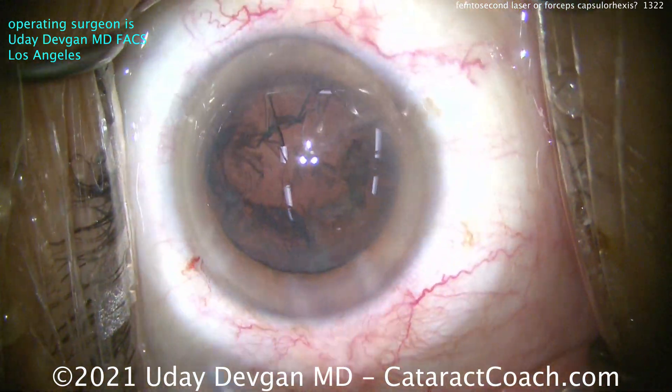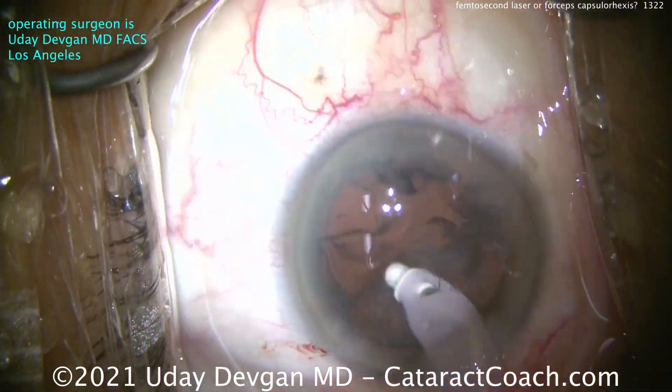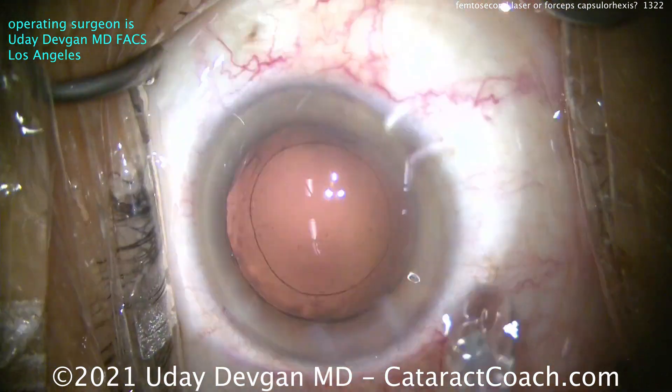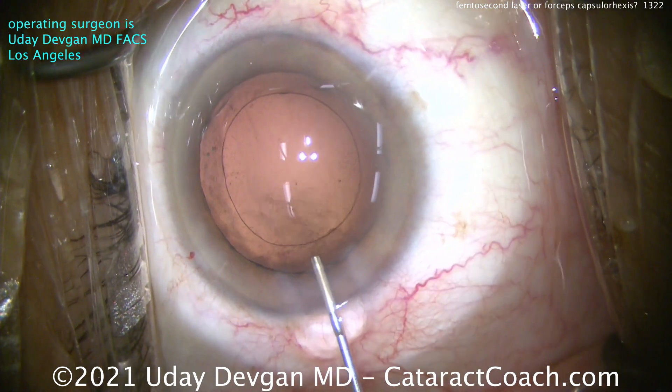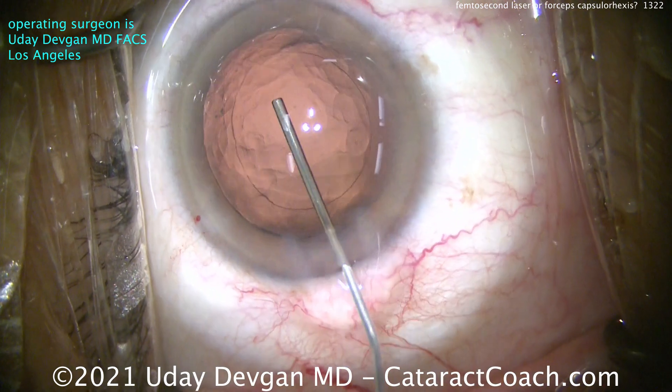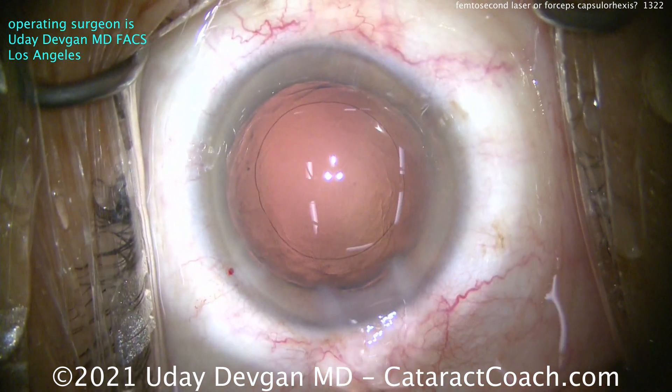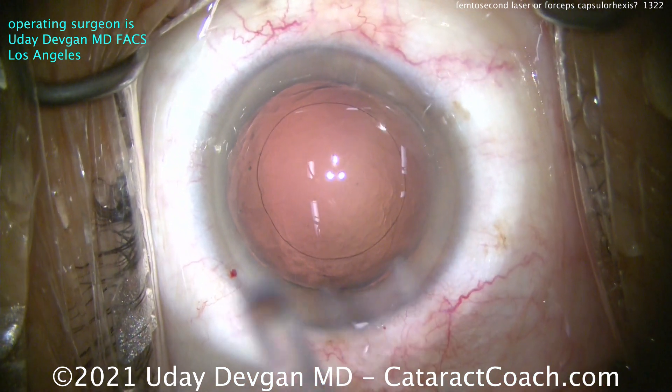The femtosecond lasers — we've had them for more than 10 years, and so many studies have been published. Let's be frank: studies have shown there's essentially no difference in the outcomes for these patients. The only thing different was for astigmatism greater than a diopter, but you would have put a toric lens in anyway.